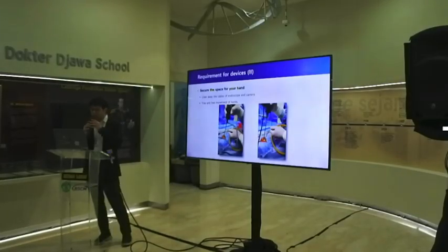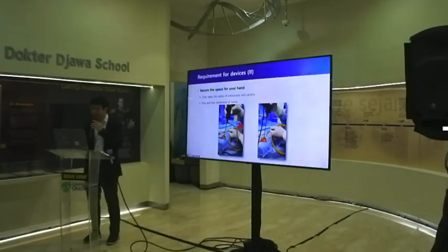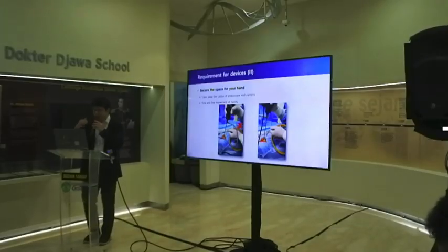To perform the surgery effectively, the devices must allow for fine and free movement of the hands. This means securing enough space for your hands and ensuring the cables of the endoscope and camera are cleared away and don't get in the way.